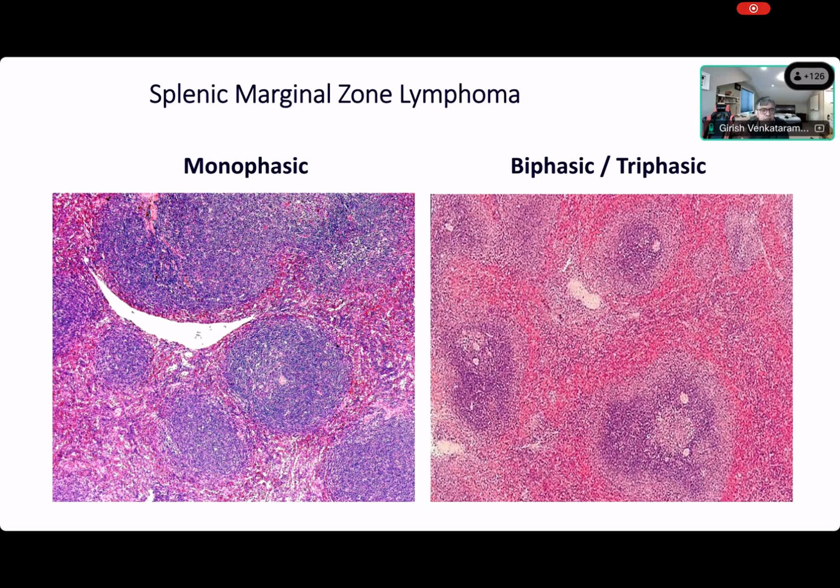And of course, I have a scrape of the spleen and I have evidence for a clonal B cell component in that spleen. So of course, I also know the diagnosis, right? But just looking at the morphology, you don't get to the diagnosis. You unfortunately have to connect all the pieces of clinical information: the flow, the morphology, the weight of the spleen. And if there was a bone marrow biopsy, check how it looked when you do the CD20 IHC. Right? Then this is how it looks.